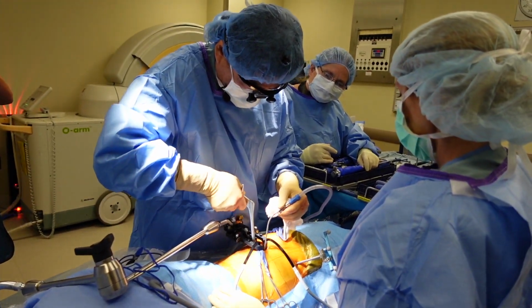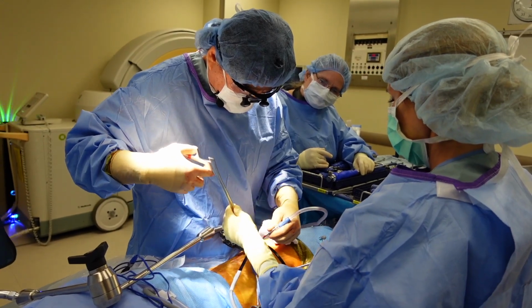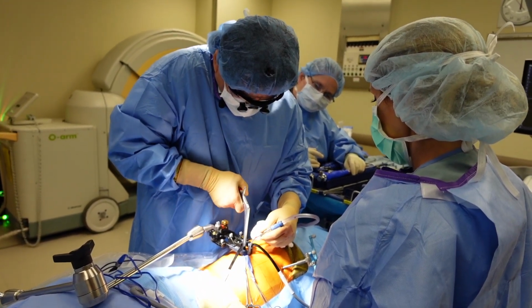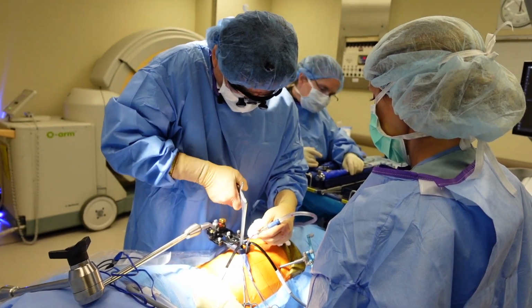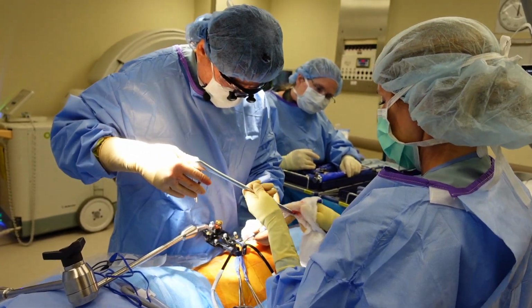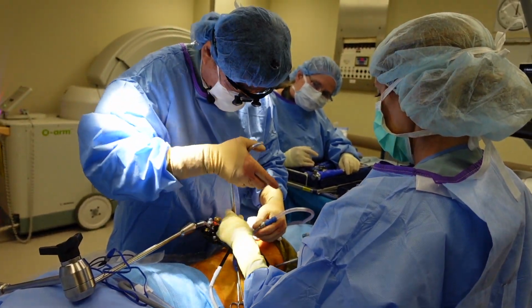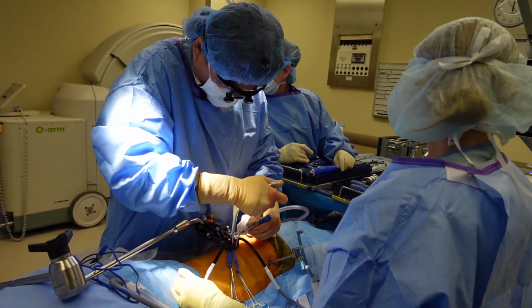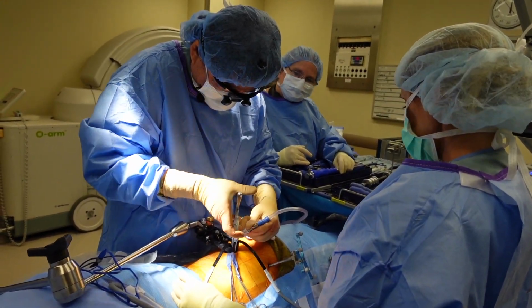And the target site is only 22 long by 10 or 12 tall. That's a tiny surgical target site. So we want the surgical corridor to match that up as much as possible.